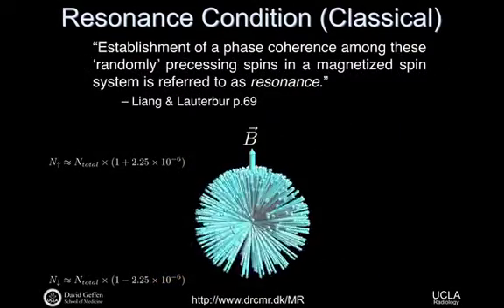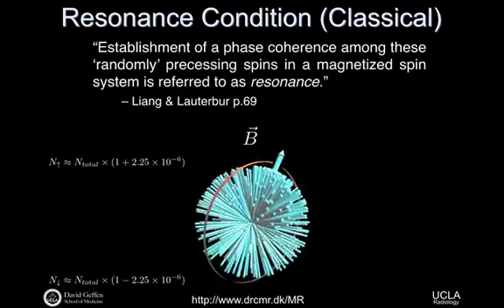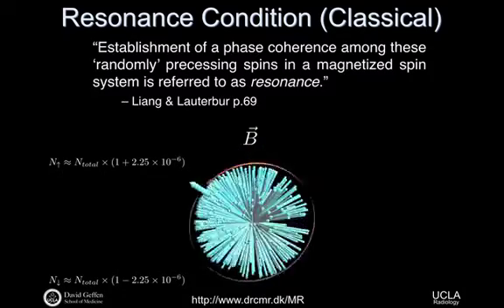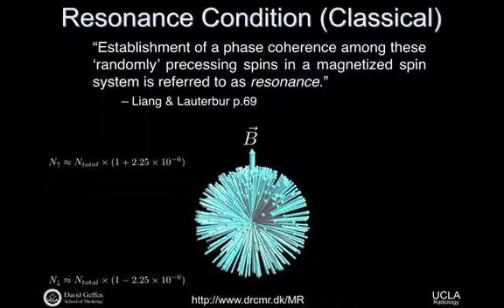And so this is another example also taken from that same Hansen paper. And this is the diagram or the movie that he uses to describe the process of excitation. So we had that state of bulk magnetization that looked like this to begin with, slightly more in the spin-up state, fewer in the spin-down state, and uniformly distributed across the transverse plane, so there's no net transverse magnetization.